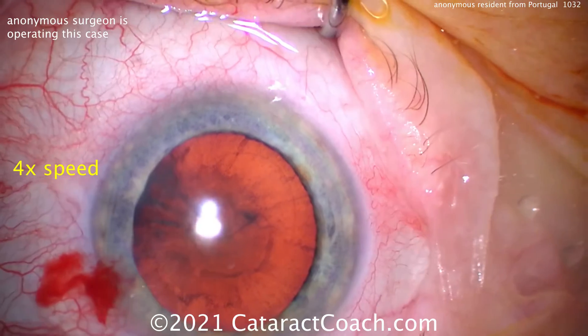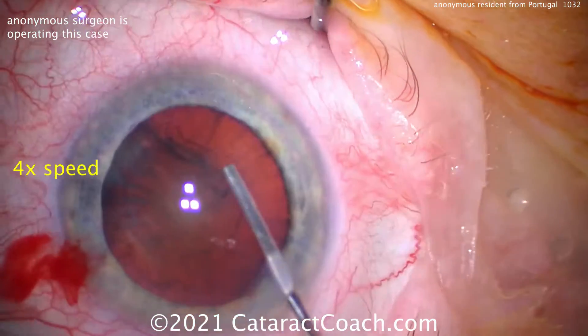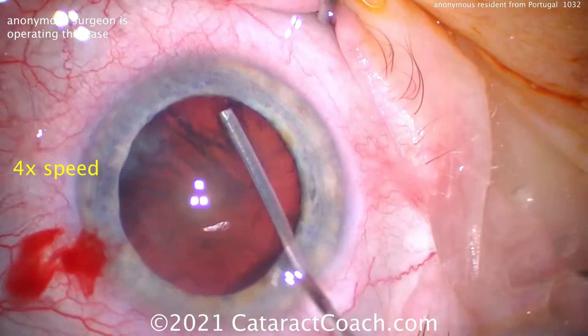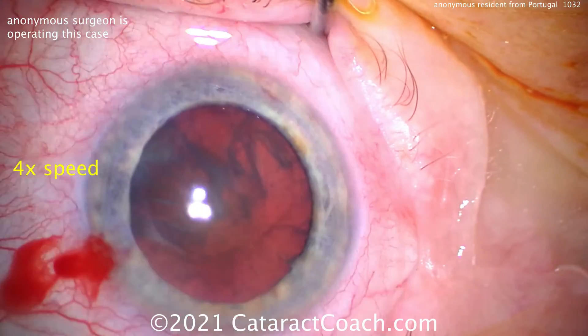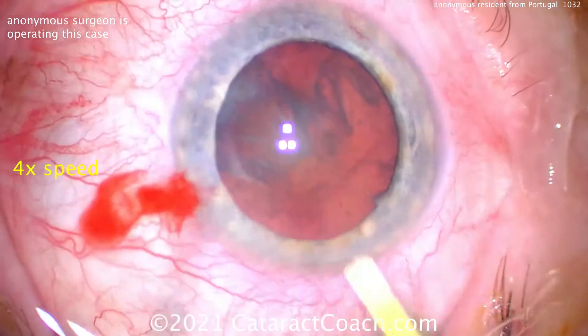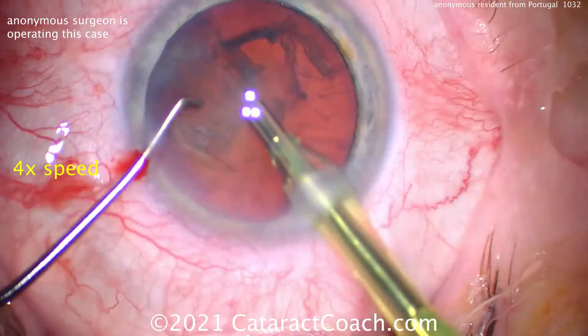The only part I can't forgive is that FACO incision — that was not good. So let's do some hydrodissection. Remember your signature: what does every other ophthalmologist who sees your patient 10 years later find out? What your incision is and what your capsulorhexis is. Make those things as beautiful as they can be.